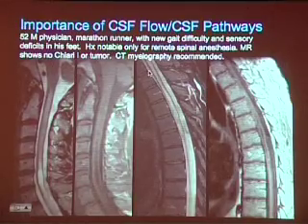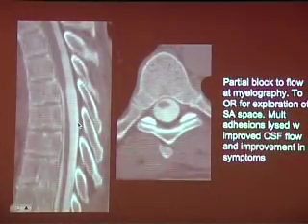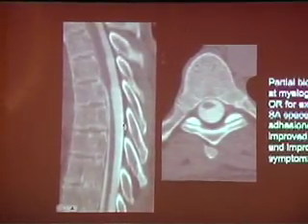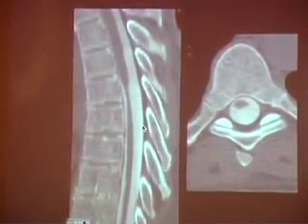So we suggested a CT myelogram in order to see what was going on with this patient's subarachnoid space. When I actually injected the guy under fluoro, you could see a block to contrast that, after you tipped him for a while, eventually relieved and the contrast passed through.